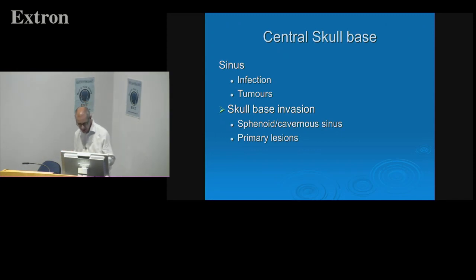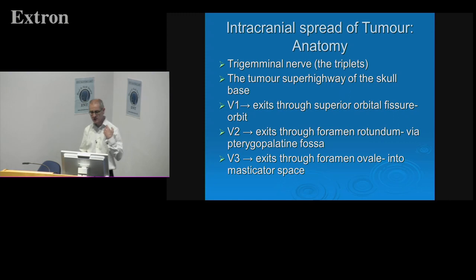Okay, this is a major topic in its own right, and for me, occupies much more of my time than most of the rest do, actually. So skull-base invasion, and this is very much around nerve roots, so you've got to know your nerve root anatomy. Obviously, you've got to know the trigeminal nerves, and I guess you all do, but just remember the routes they're taking, and therefore the directions you're expecting tumour to spread in.